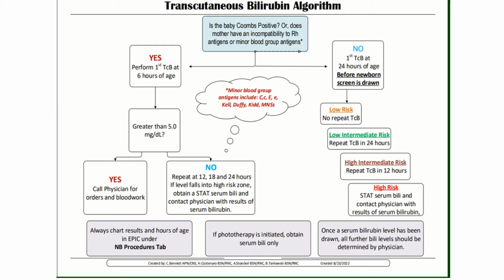Please ensure this happens. The lab will be notified of this change in practice, and we will be asking the phlebotomists to do their best to notify the nurse prior to drawing the newborn screen. However, we're just asking that everyone be as proactive as possible in obtaining the transcutaneous Bili as close to the 24-hour mark as possible.